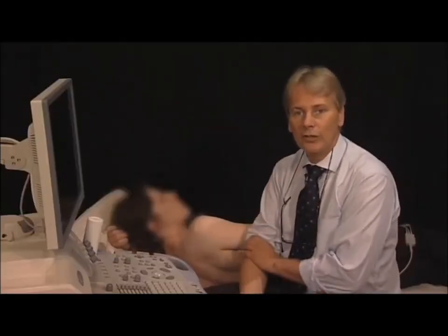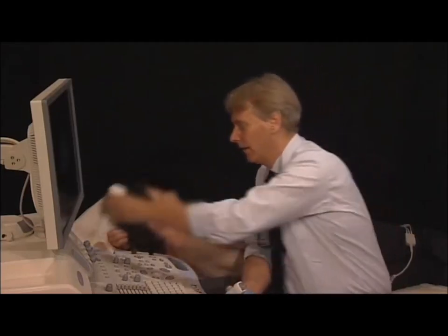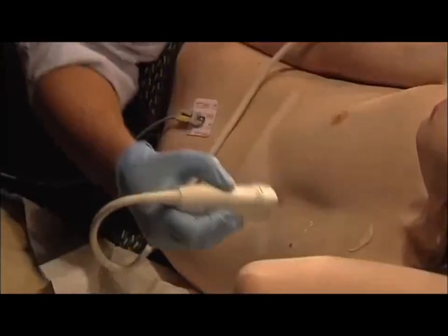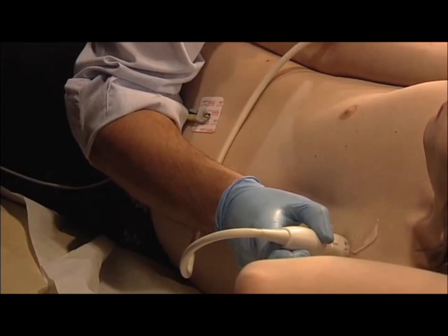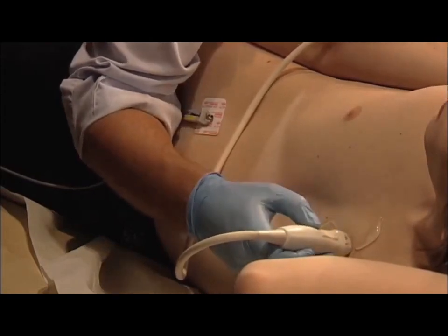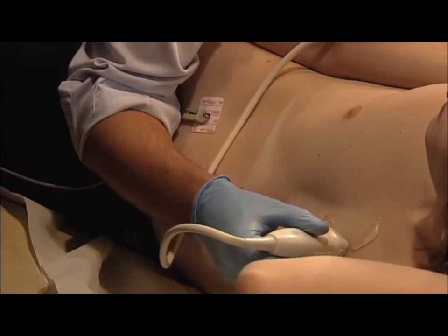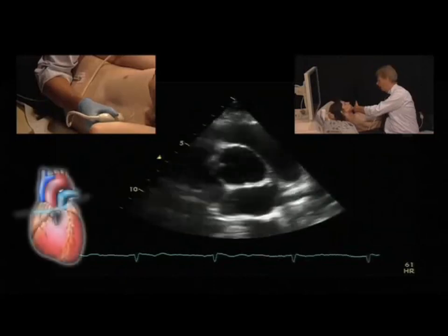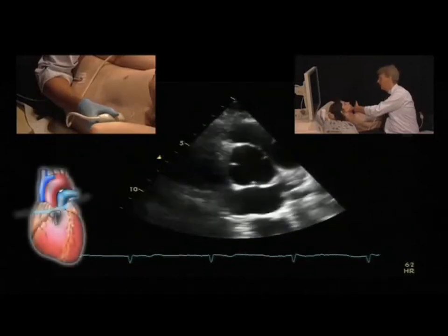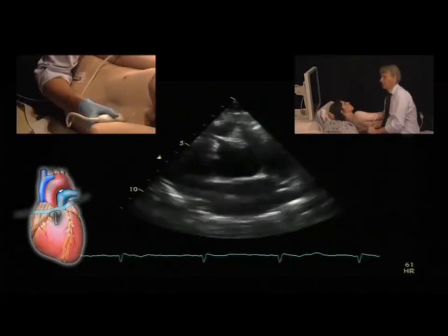The parasternal short axis is in a 90-degree orientation to the long axis. So if you remember how we had the long axis, the marker was pointing towards the right shoulder. Now what we have to do is rotate the transducer clockwise until we are perpendicular to the original plane. Now the marker, which is here where my finger is, points towards the left shoulder, or armpit actually.